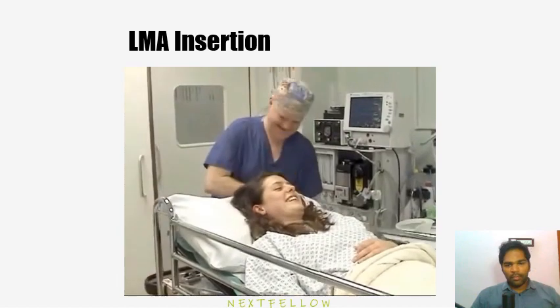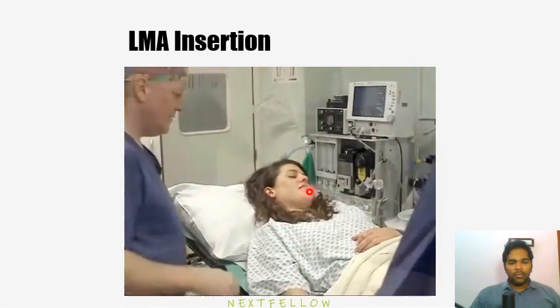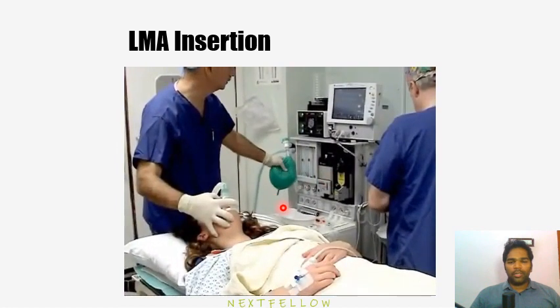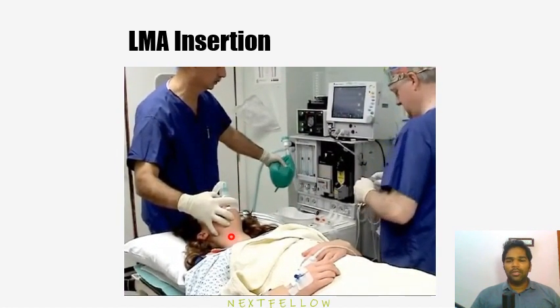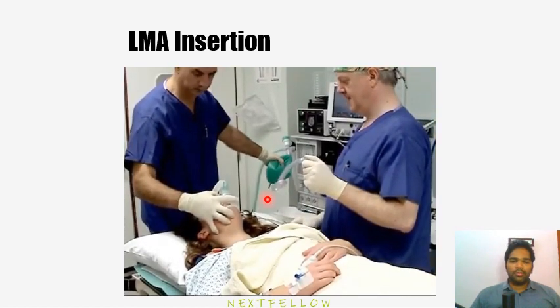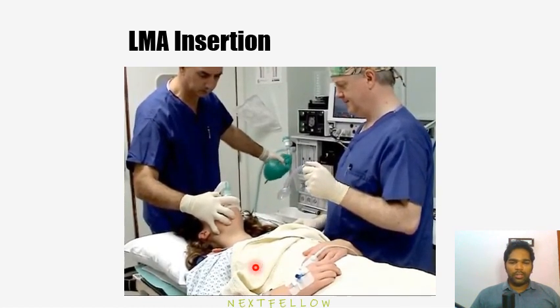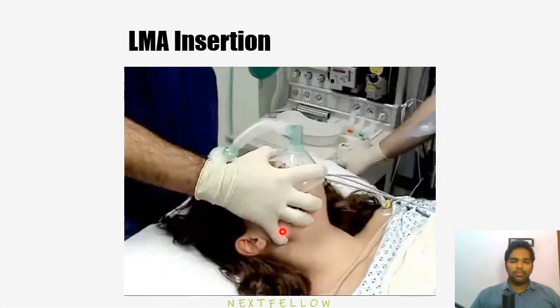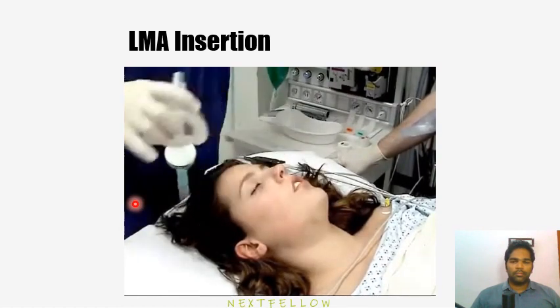Once the patient has been suitably prepared to receive the laryngeal mask, the patient is ventilated. It is best held at the proximal end, just below the 15mm connector. The slightly larger diameter tube allows greater control when introducing the cuff portion into the patient's mouth. Under direct vision, hold the tube between fingers and thumb.